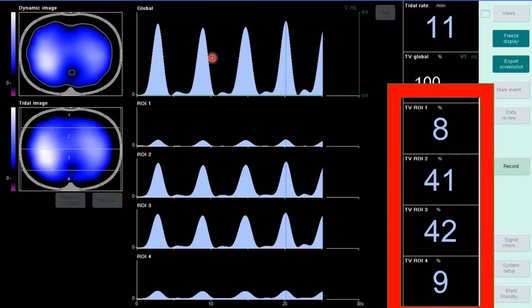These curves here are the impedance curves, but like we mentioned initially, impedance is volume. So they're pretty much equal. These would match the volume curves that you would see on your ventilator.